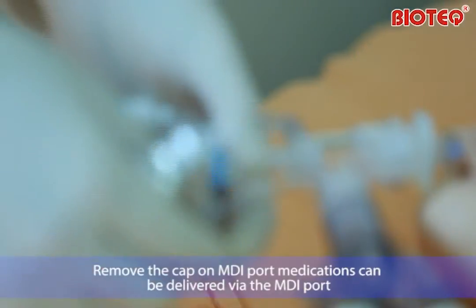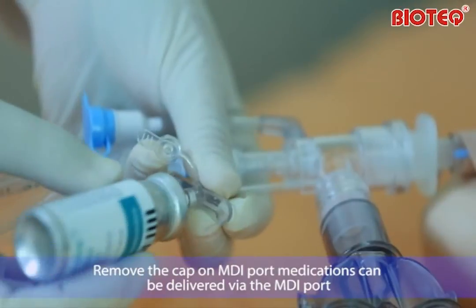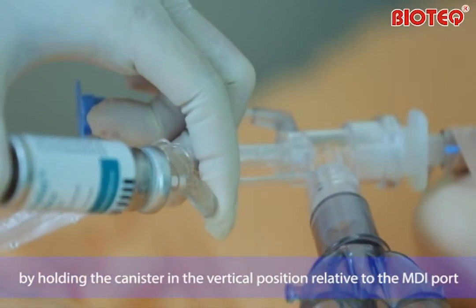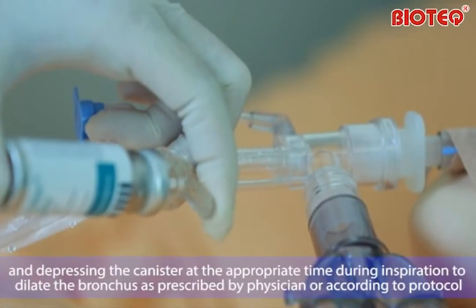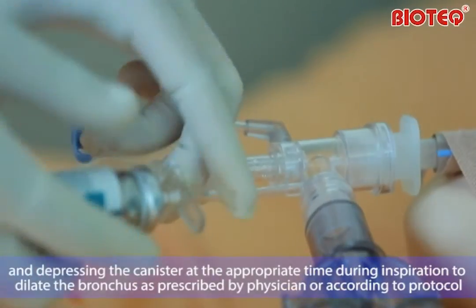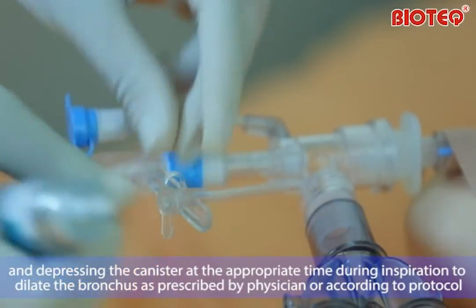Remove the cap on the MDI port. Medications can be delivered via the MDI port by holding the canister in a vertical position relative to the MDI port and depressing the canister at the appropriate time during inspiration to dilate the bronchus, as prescribed by physician or according to protocol.